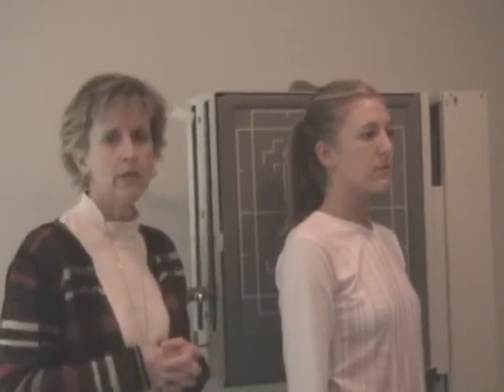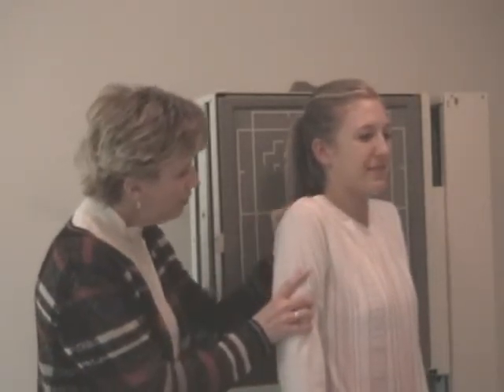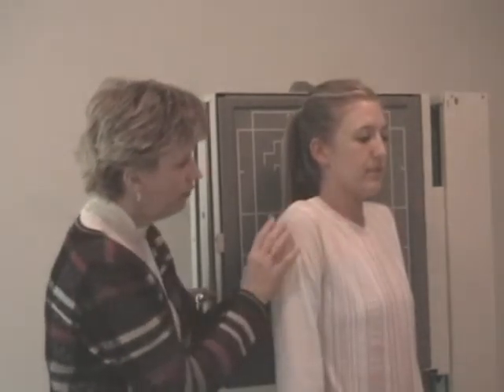Study your patients. Many patients have short necks. A patient with a short neck is going to cause you a little bit of concern, because it is absolutely necessary that you demonstrate C7. And when I say C7, you should automatically assume the adjacent bone, which is part of T1. You need the joint space between C7 and part of T1 on there. And somebody who doesn't have a short neck, this shoulder is going to be right over that seventh cervical vertebra.